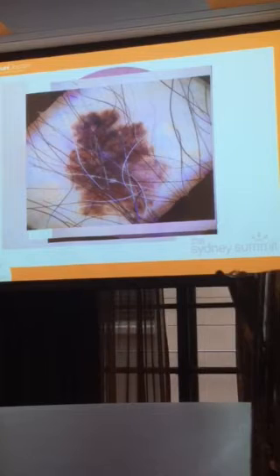This is what I saw on dermatoscopy. It was no less striking macroscopically. It stood out like the proverbials on his tummy. It really was an obvious lesion. And I pointed this out to him. I went through the areas I was worried about. I pinched into the regression area. I looked at everything with him.